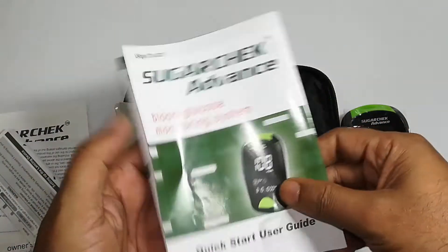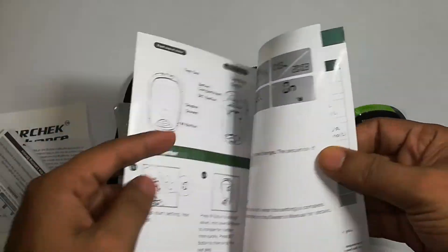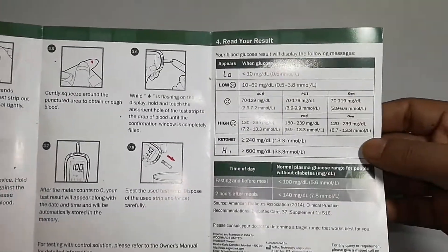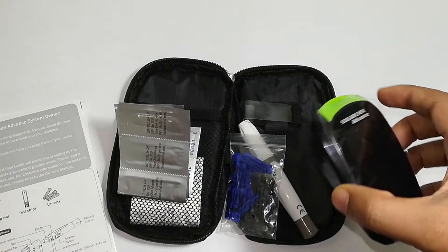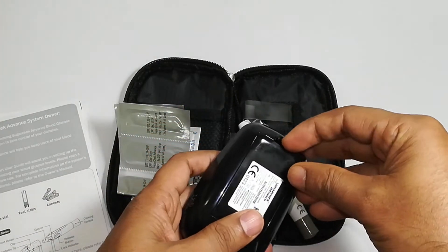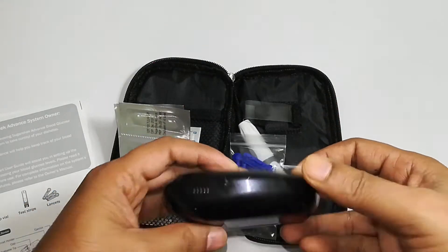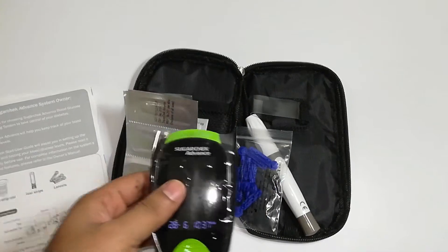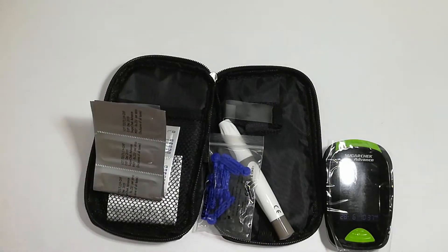This booklet has the details of how the device has to be set up and the basic steps to do blood glucose testing. It also provides two batteries — I'll just put them inside. So the two batteries are set up and now I'll try to do one test for myself.